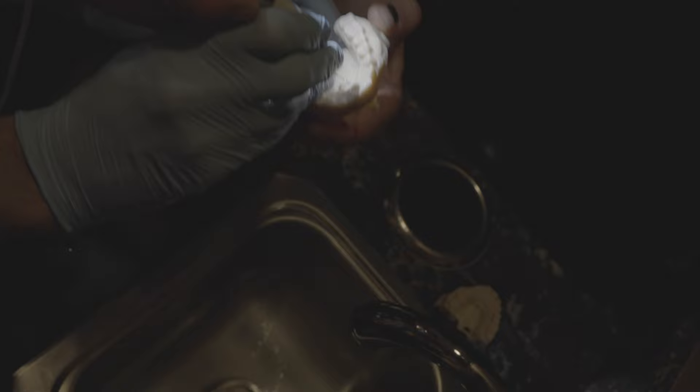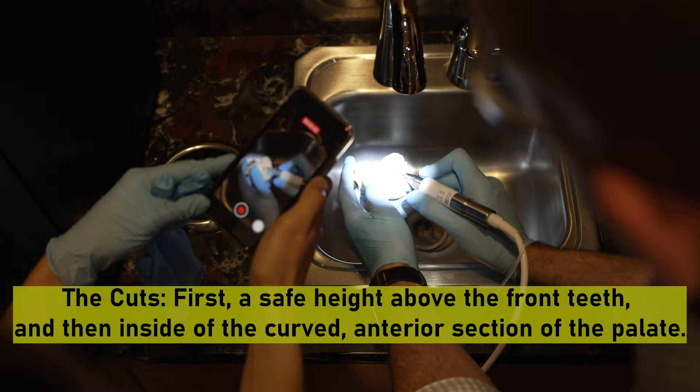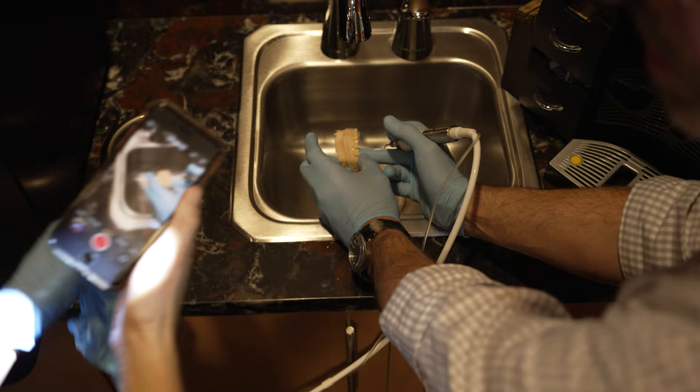You're essentially going to be meeting the two points — that's the goal, to connect those two cuts. Everything in between is cancellous bone, so that's really not a problem.